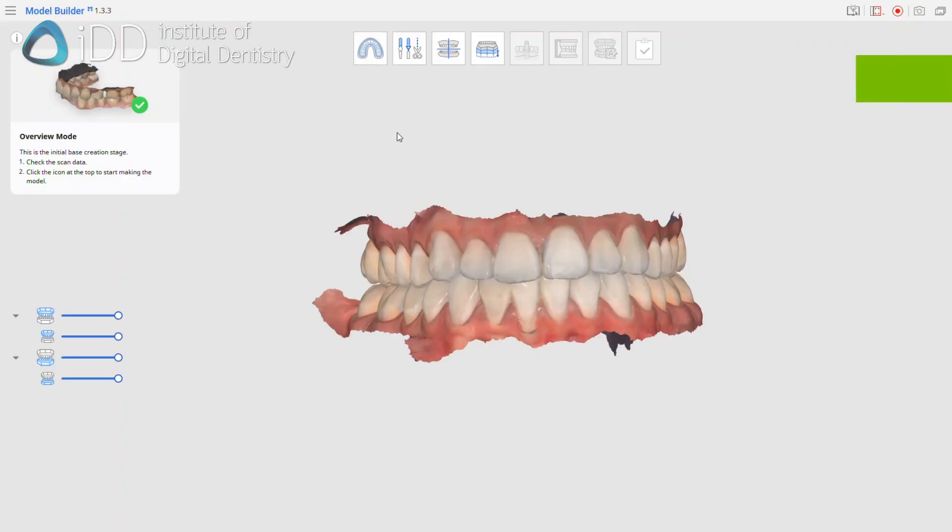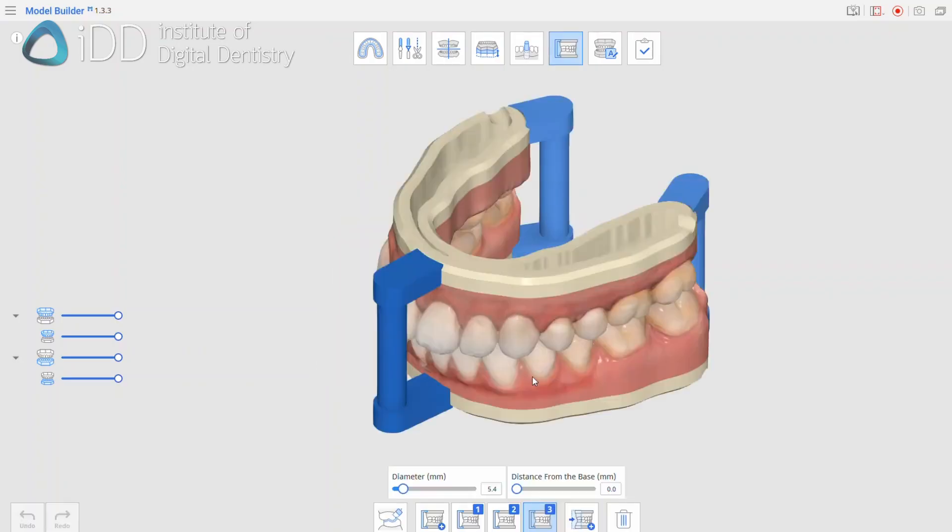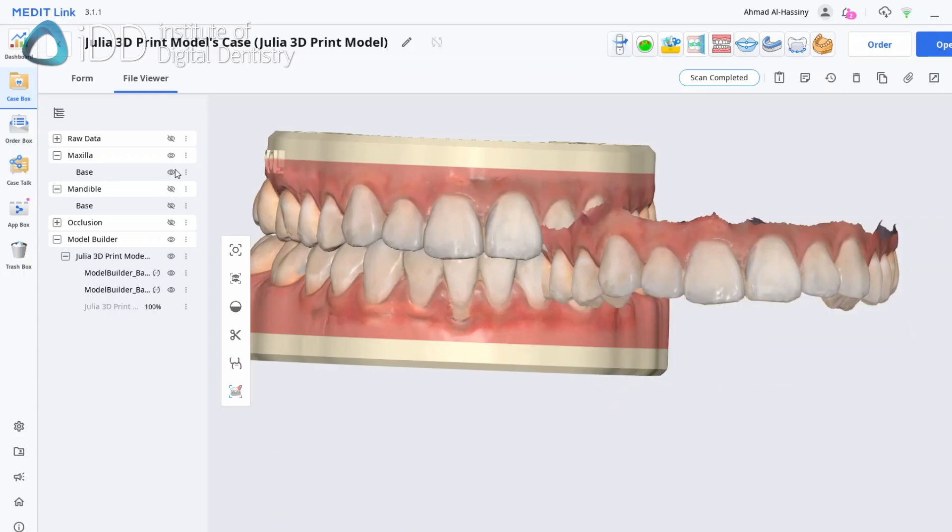The scans are then imported into a model builder software. In this case, we are using the Medit model builder. In this software, we convert the mesh scans into a printable model.